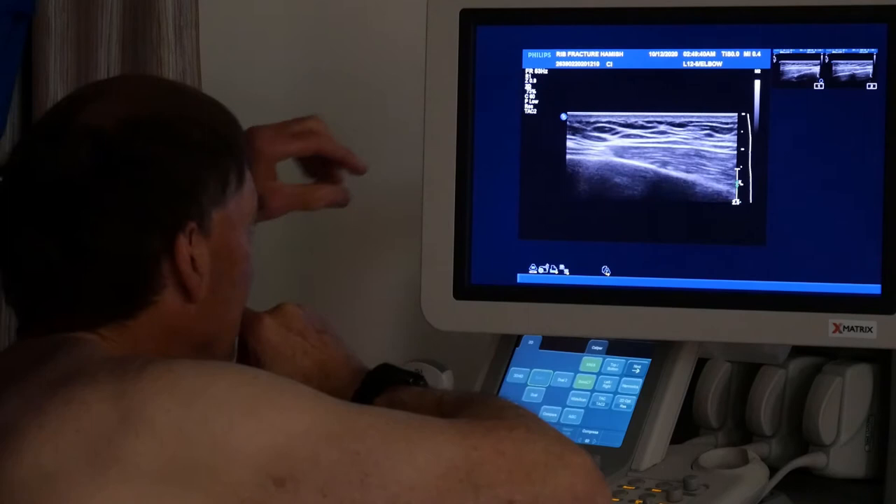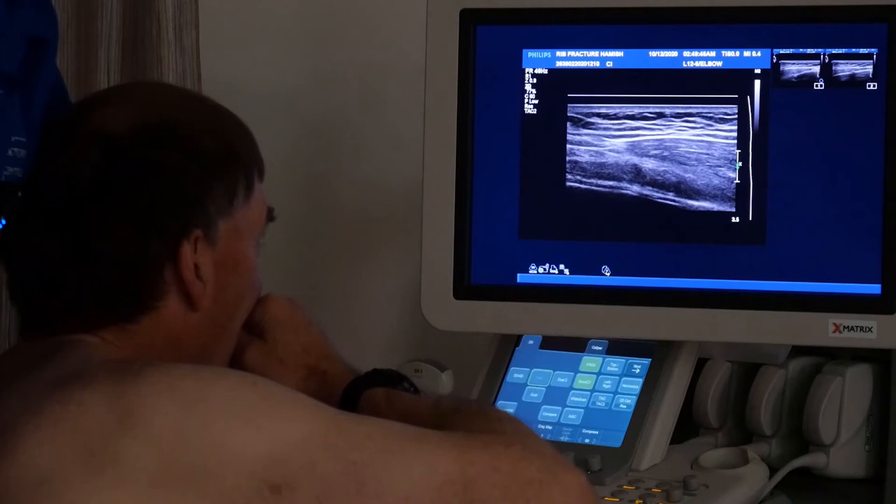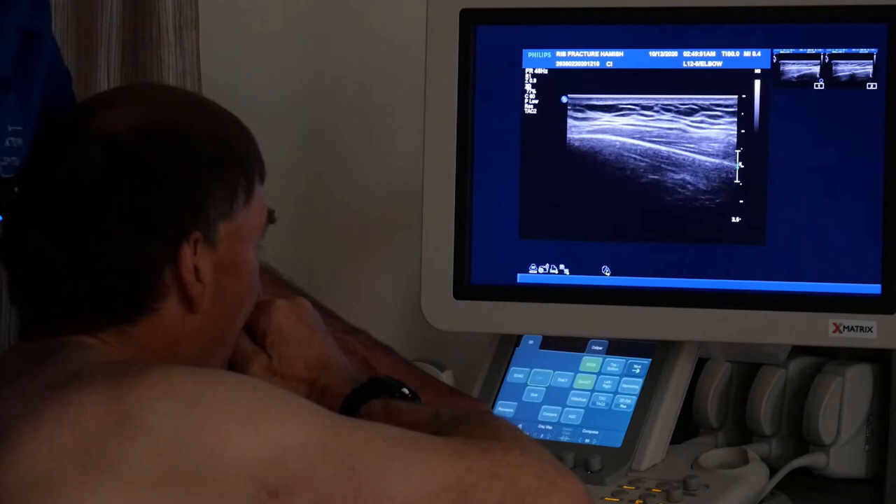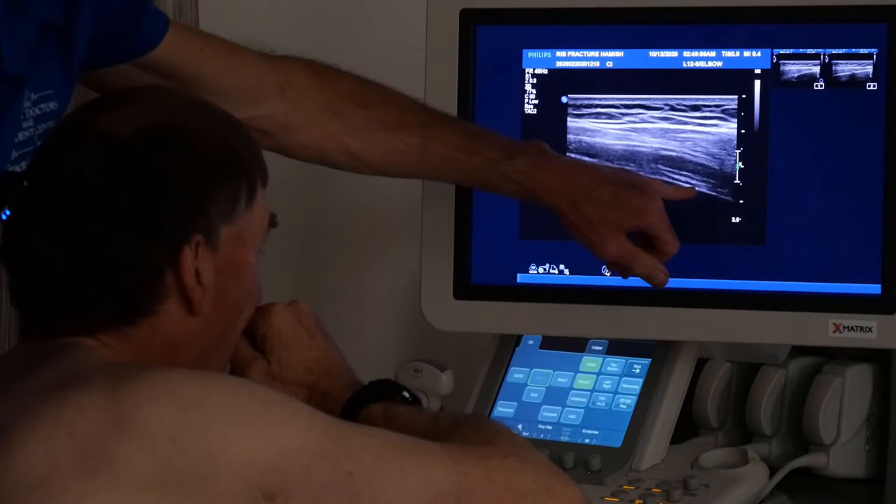Three weeks old, but fresh ones look a bit like that too. So that's how you do it. You can look in between the ribs - we're still following the line of the ribs, looking between the ribs. That's the rib below, and go below that we see the lung down there between the ribs.